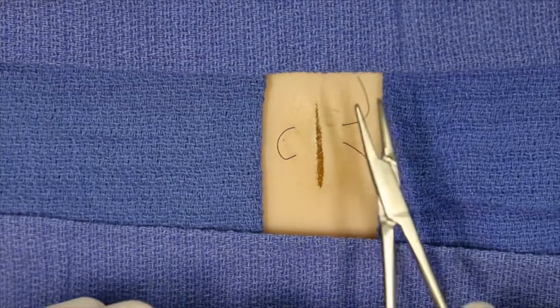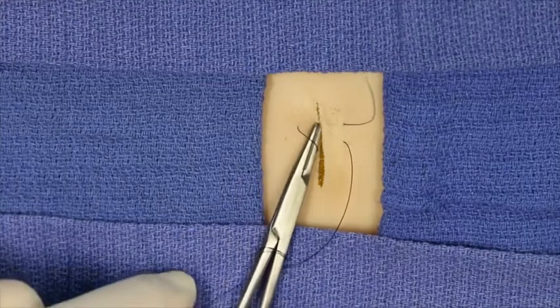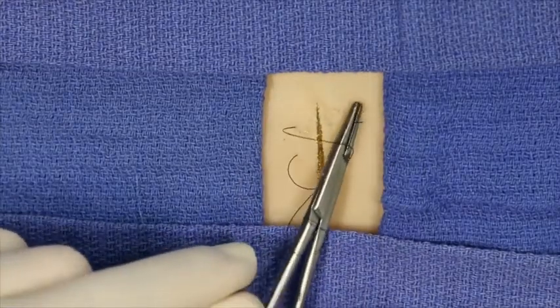But then instead of grasping the tail, the needle driver instead passes under the loop, then grasps the tail.